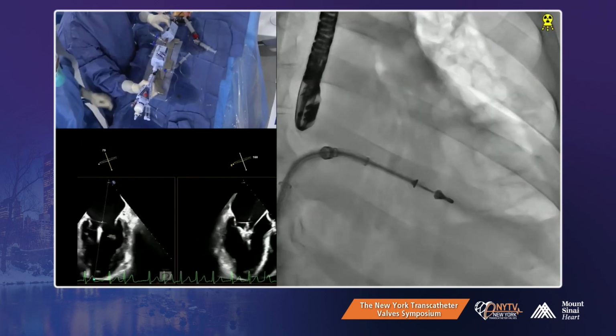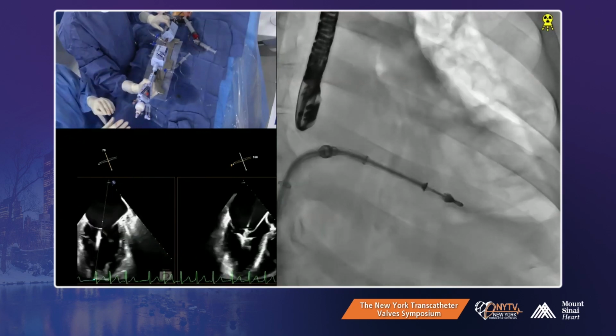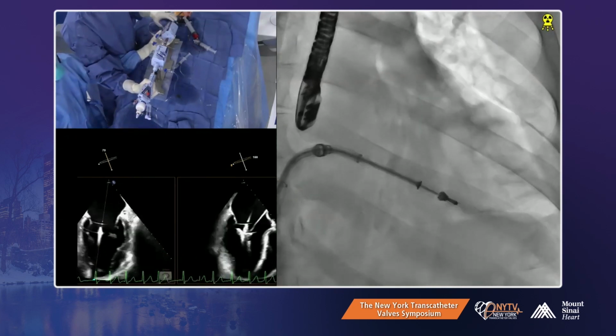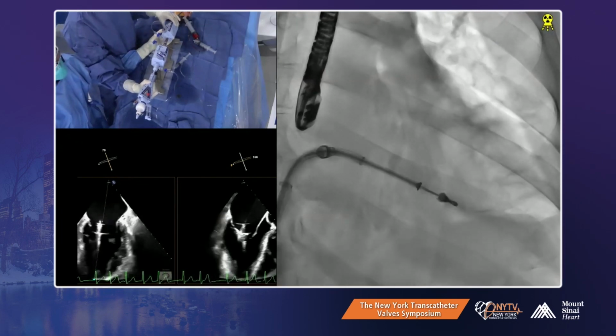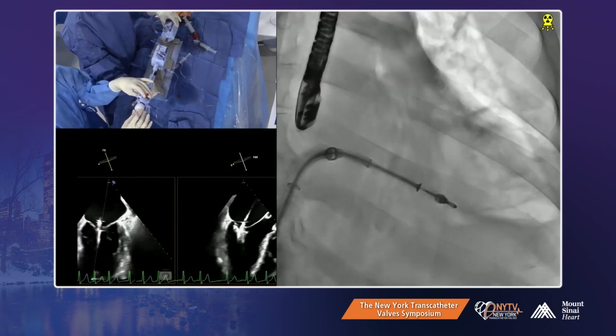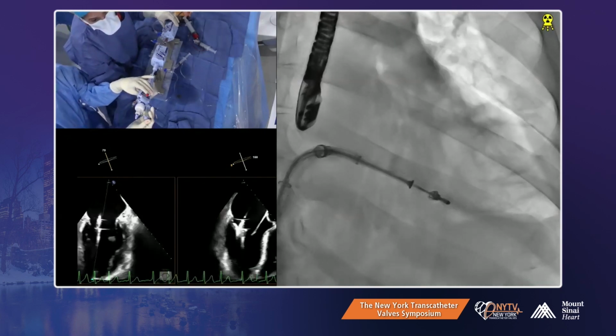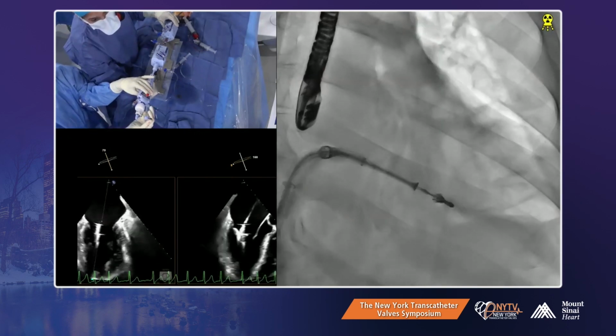Yeah, there you go. You can see the anterior is on. The arms a little bit more now. Anterior is on. Now go posterior. Close anterior. No, we lost anterior. Posterior is on nicely.